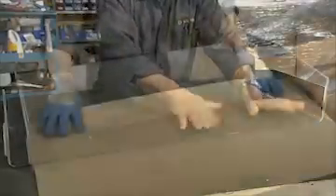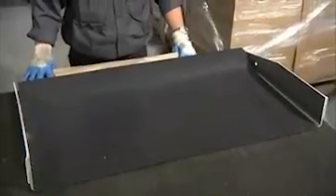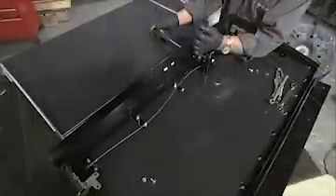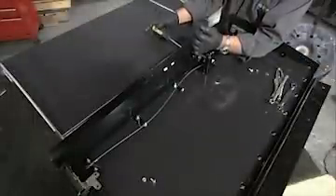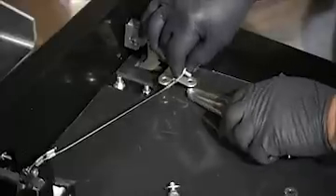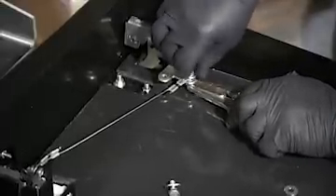A technician applies a gritty material with an adhesive backing. He simply presses it to the ramp and smooths out any air bubbles. This gritty material will provide a slip-resistant surface for the wheelchair to move across. He attaches a handle and installs 2 cable assemblies to connect the handle to the ramp latches.